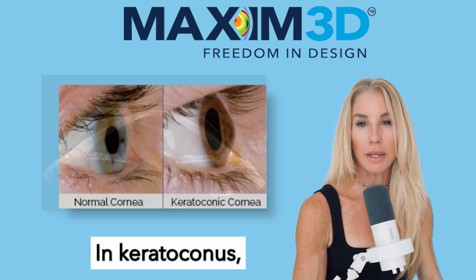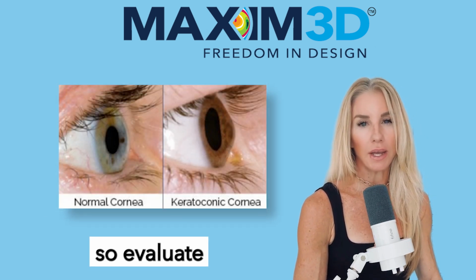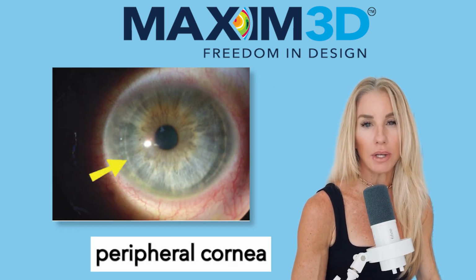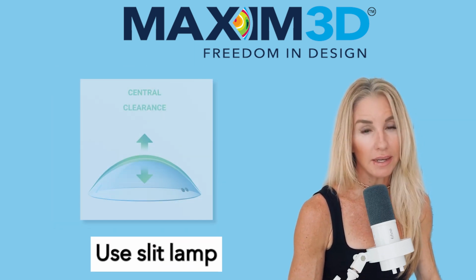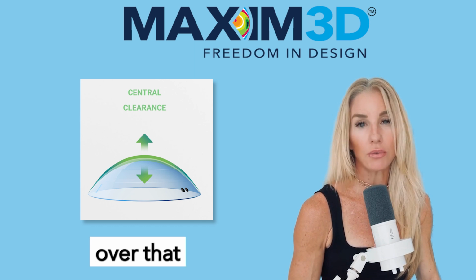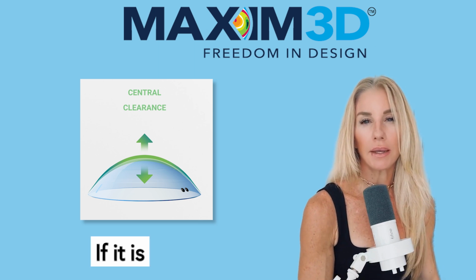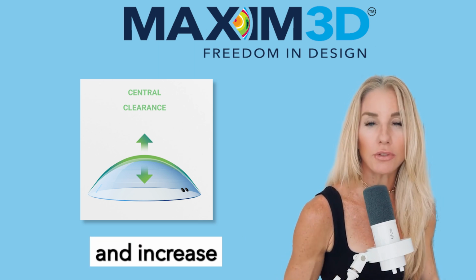In keratoconus, the apex is often central or slightly inferior, so evaluate directly over the cone. In post-LASIK or post-RK, the mid-peripheral cornea may be the peak, so assess accordingly. Use slit lamp optic section or an OCT to assess vault over that highest point. If the lens is too shallow, you risk mechanical touch and corneal staining. If it is too deep, you may reduce oxygen transmission and increase fogging.